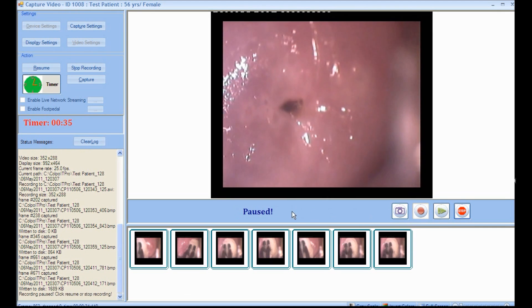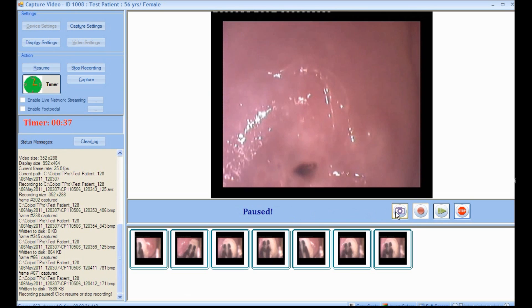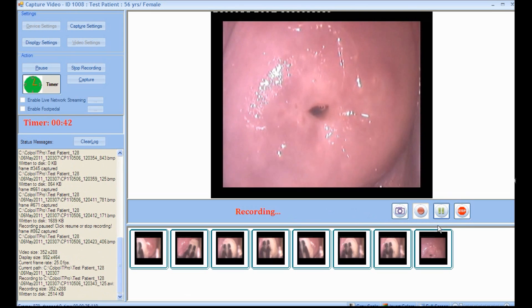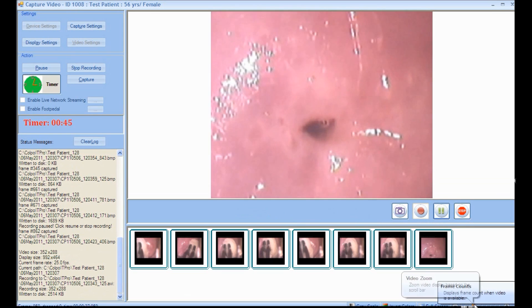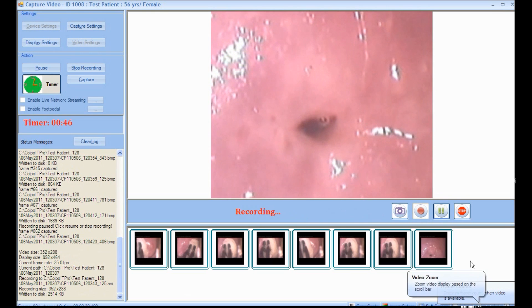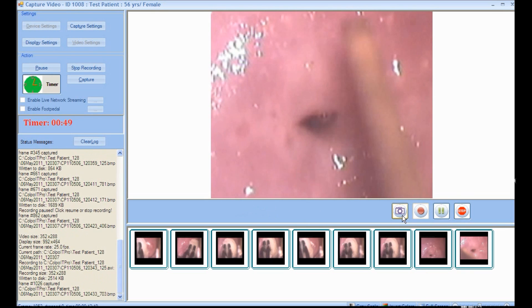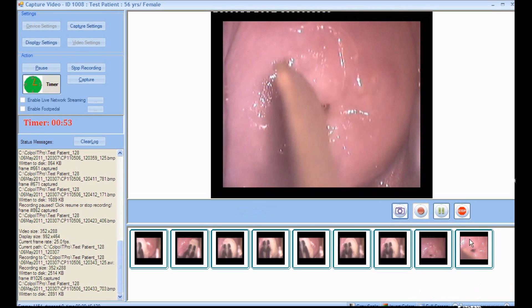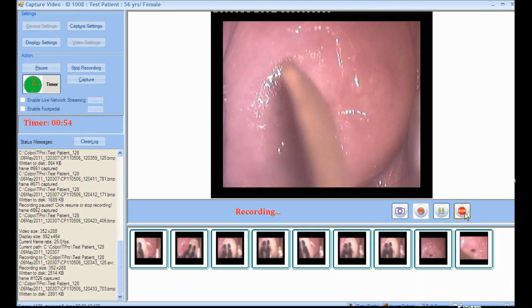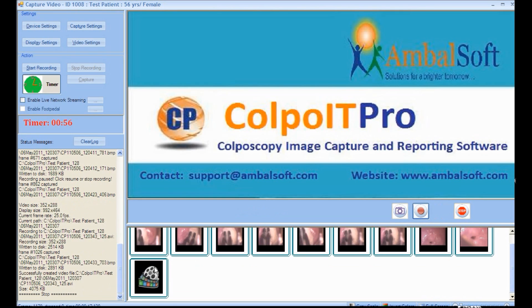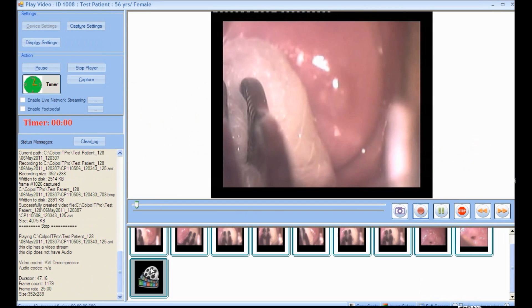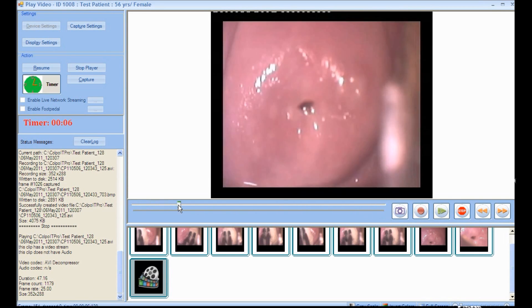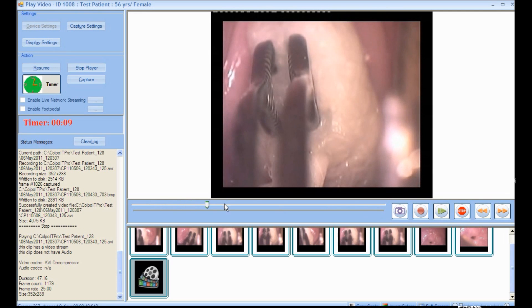Even in pause mode, the preview runs and snapshots can still be taken. Extra features like zooming options are also available. To stop the recording, click the Stop button and the respective video thumbnail appears below. To play back the video thumbnail, double-click it. Click the Pause button, drag the slider wherever necessary, and take the snapshots.